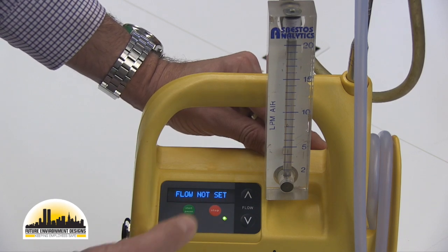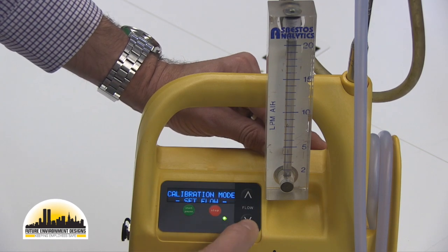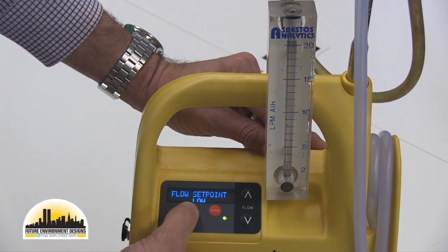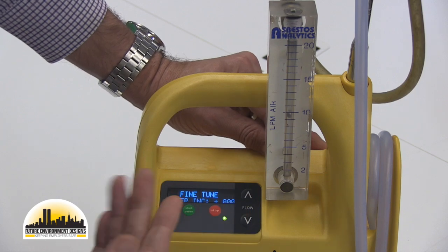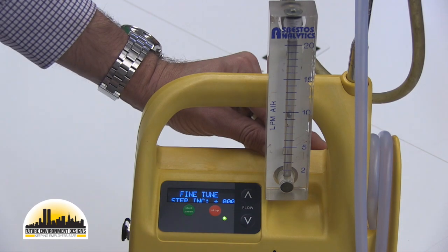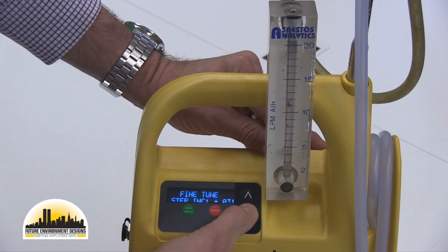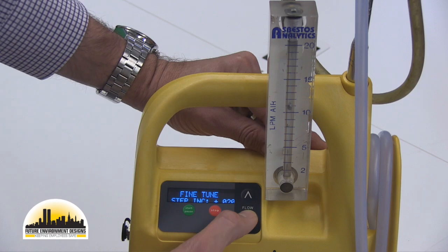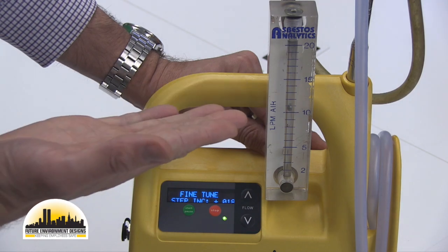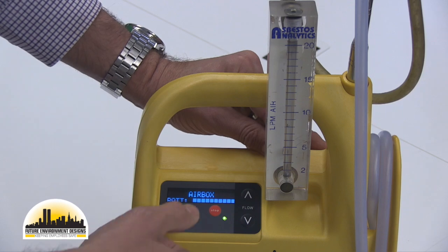What you find is if you try and start it straight away, it'll say flow not set. So to set the flow, we just press the down button there. It'll give you a calibration point. Automatically when it comes up, this is coming up at just under 9 litres a minute. To increase or decrease that, it's just the up or down arrows for that digital control. So if we're setting to about 10 litres a minute, once you've got your selected point, press stop. So now it's calibrated to 10 litres a minute.